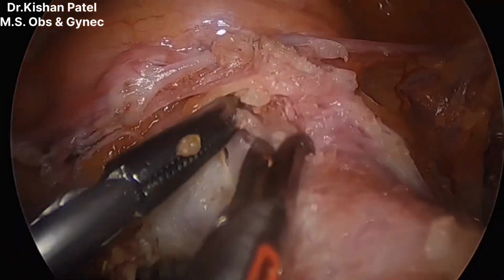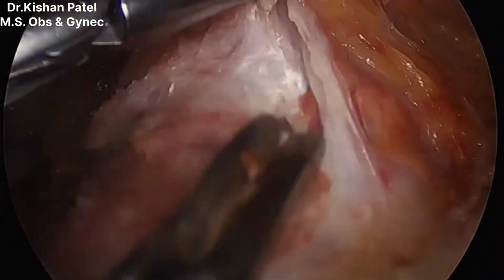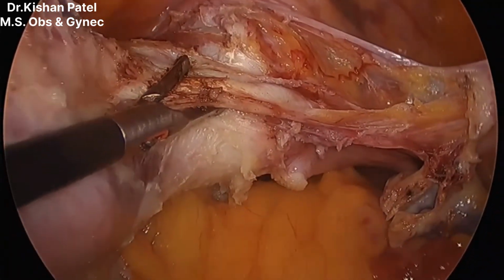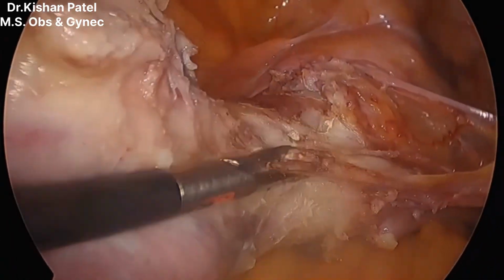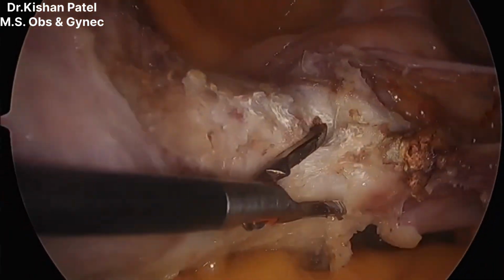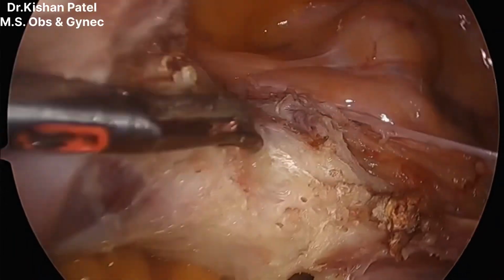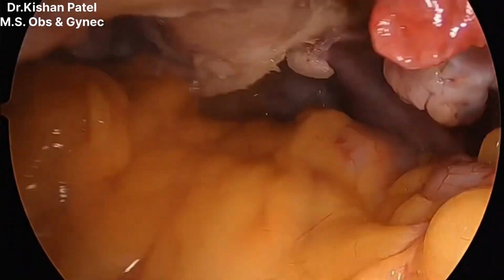for better safety. So we will do colpotomy by the monopolar on this pericervical ring demarcation, right? I have reached the opposite side, then we will coagulate and cut from the right side. Right uterine artery and vessels are coagulating and cutting. As we are coagulating, cutting, we will go posteriorly to match with the uterosacral ligament. We are matching with the pericervical ring anteriorly. We are inspecting.